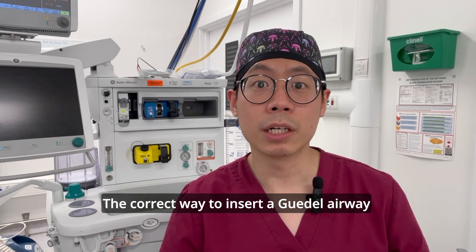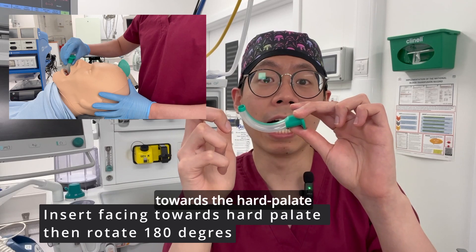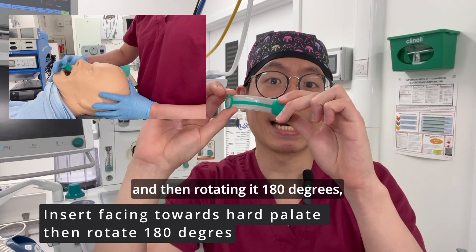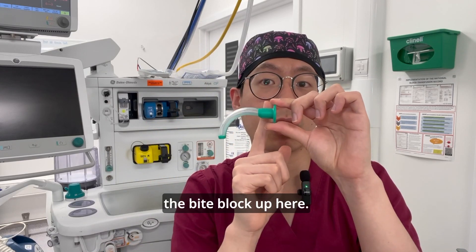The correct way to insert a Guedel airway is to first insert it into the mouth with the angle facing towards the hard palate, and then rotating it 180 degrees, advancing it in until the incisors reach the bite block up here.